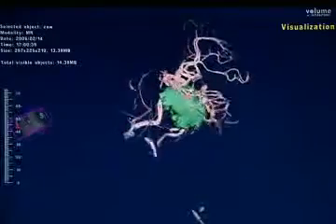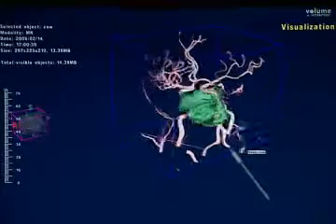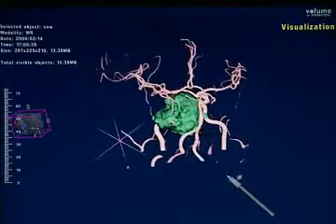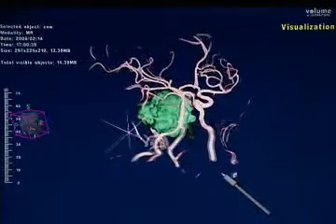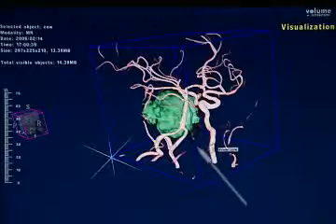And you could turn it around, and as you can see, this is the carotid artery, for which the tumor involves the petrous part. And this part is never going to be removed. That area around the cavernous carotid, again, is where the tumor involves the cavernous sinus. But of great interest would be the basilar artery from a practical perspective, because you want to know where the basilar artery is. And of course, an experienced skull-base neurosurgeon can pick up that information that you want from 2D. That may not be very apparent to the surgical resident. And in this situation, we can see that the basilar is really shifted away, and it also involves the vertebrobasilar junction.